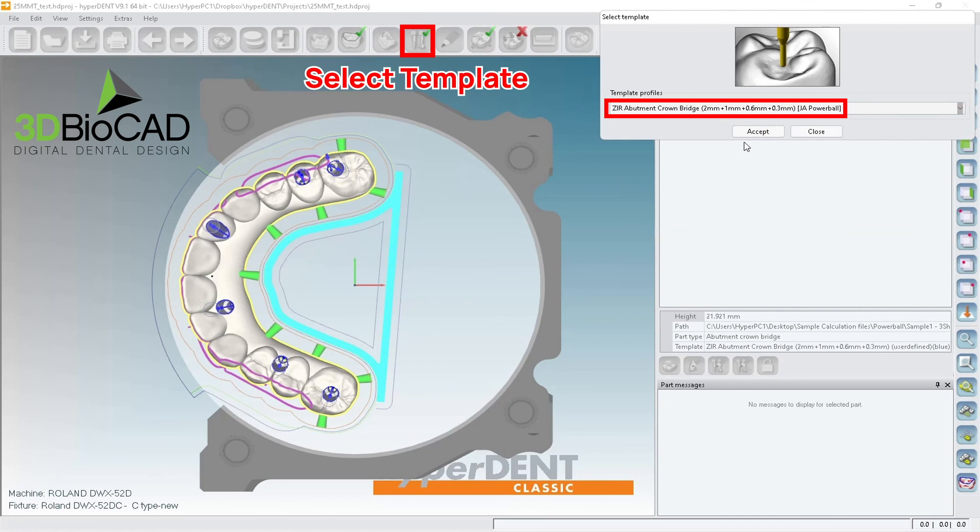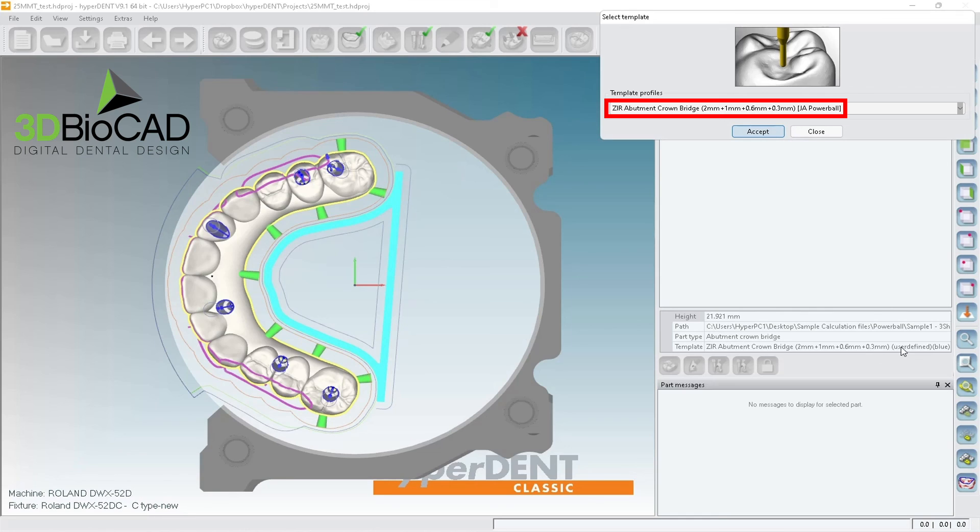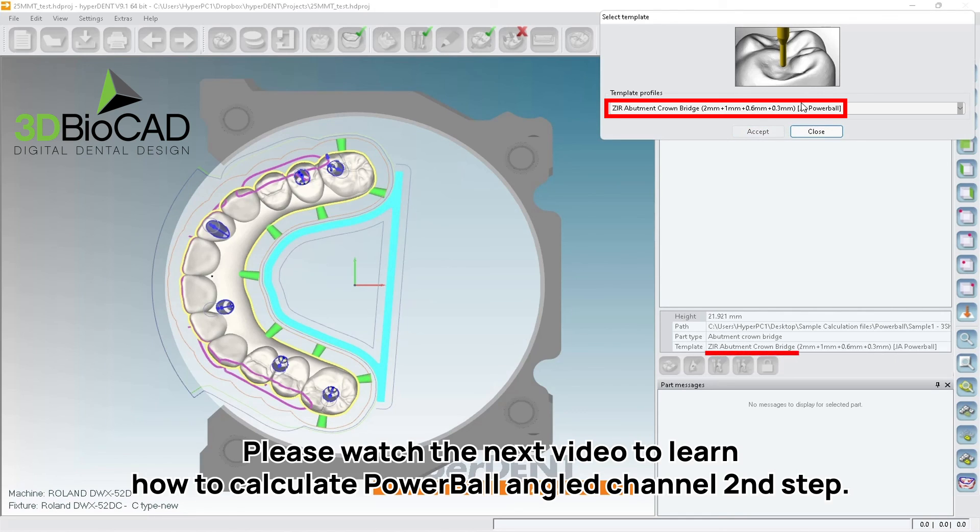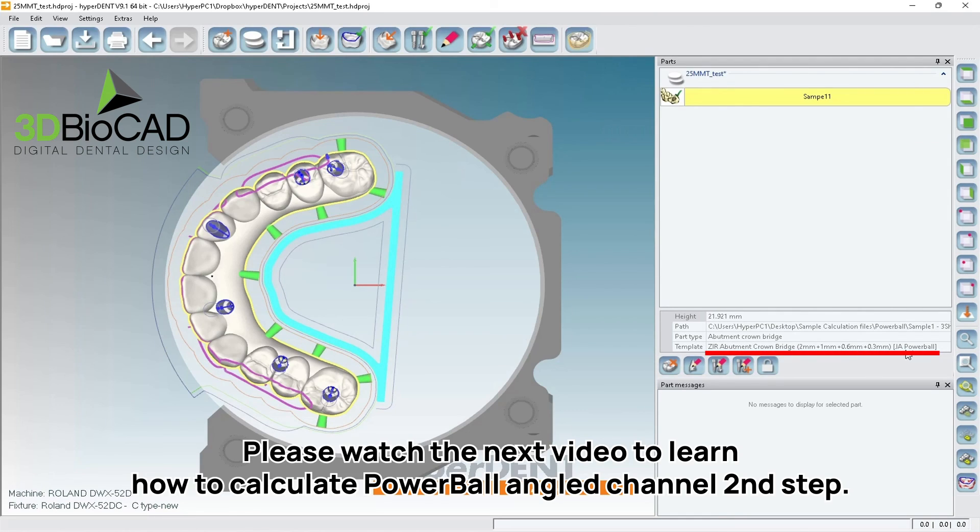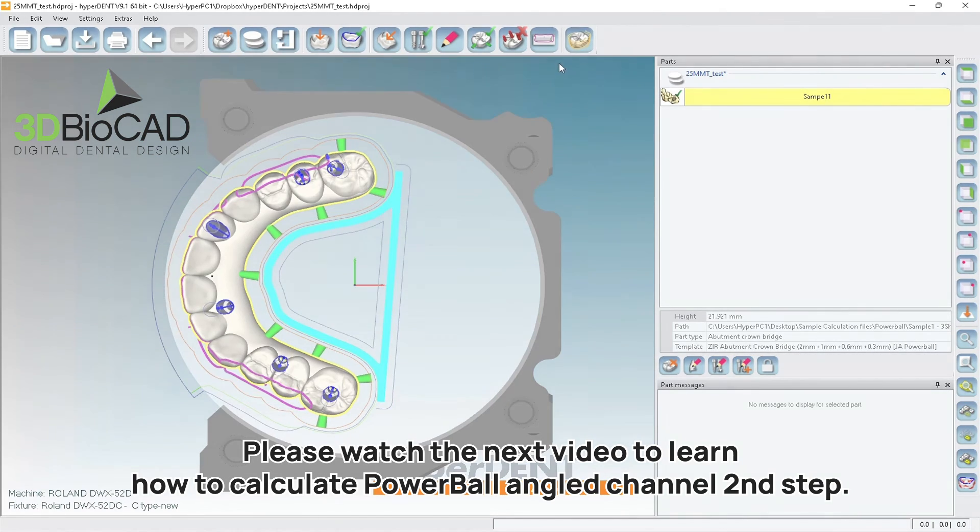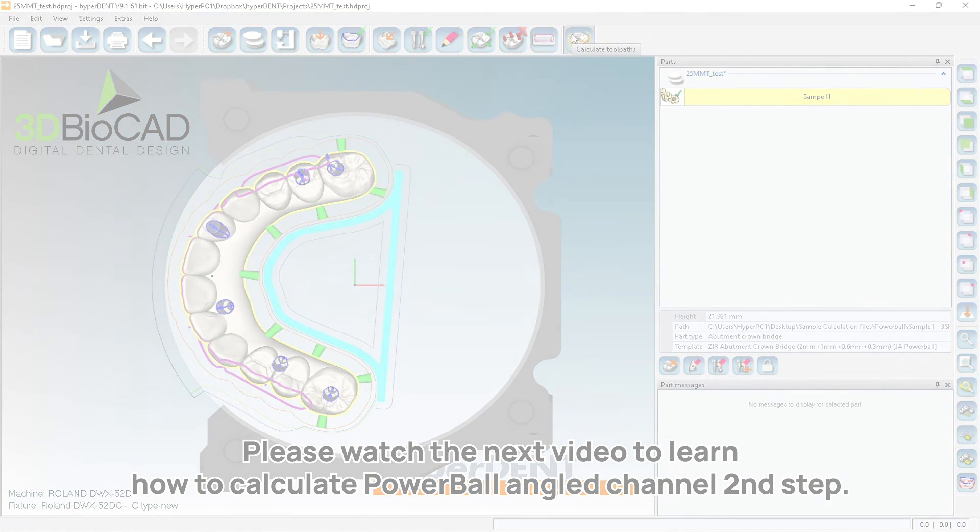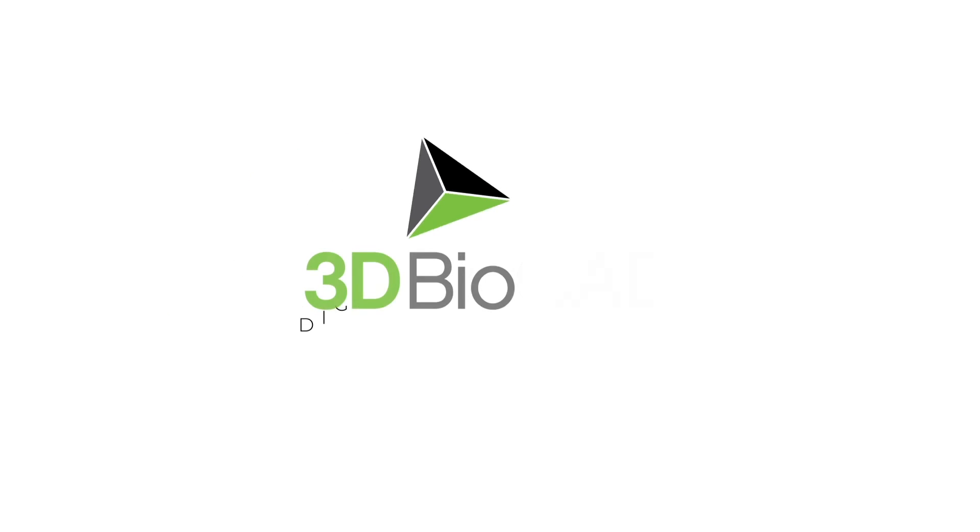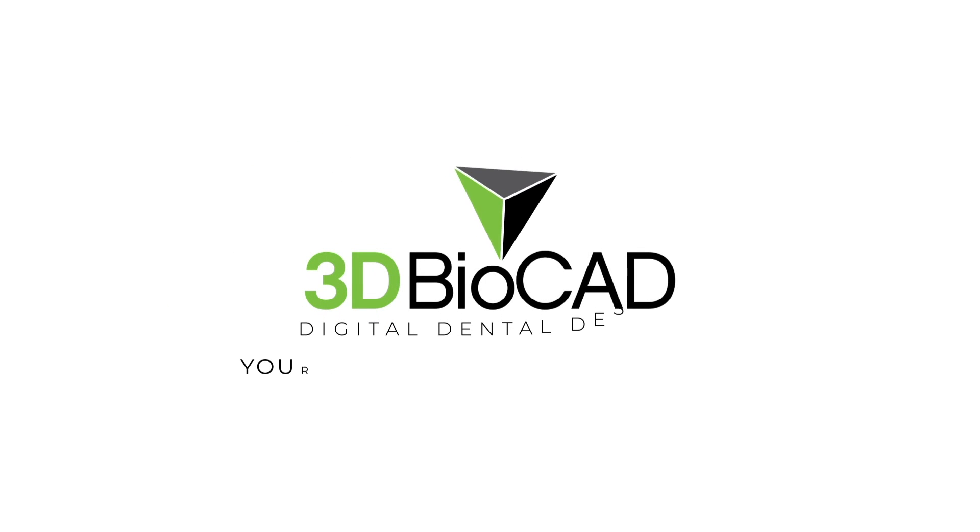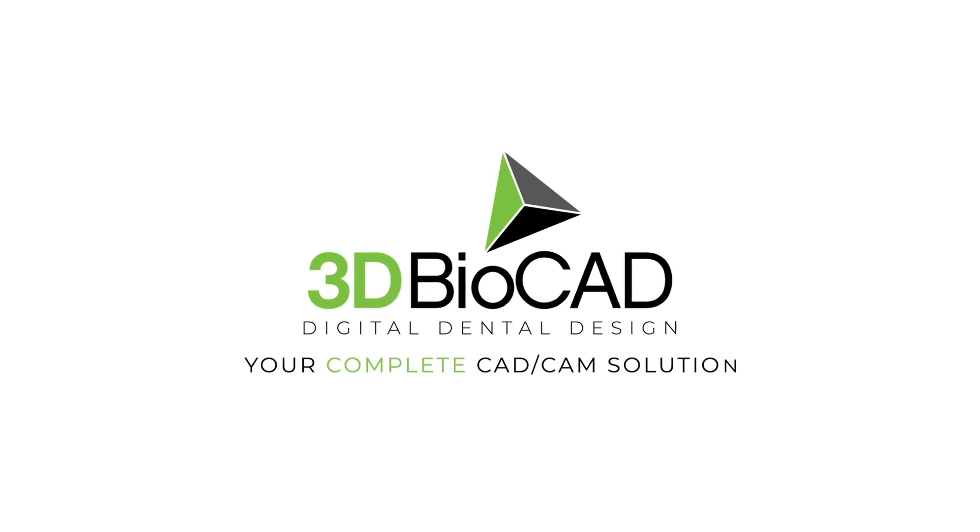So make sure you choose Powerball, accept. Make sure you change this template to be Powerball. So this is Powerball.